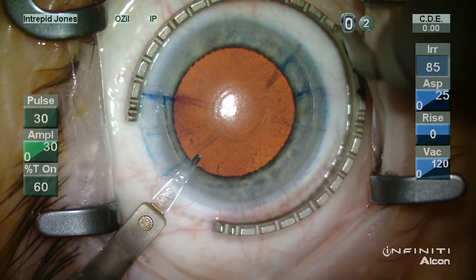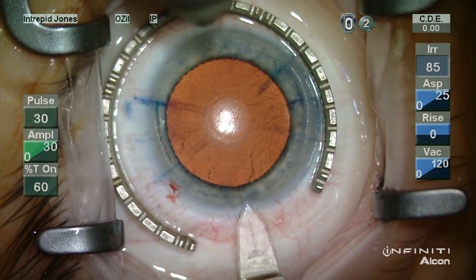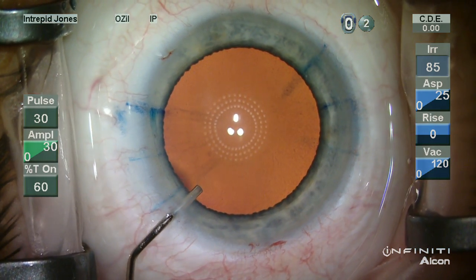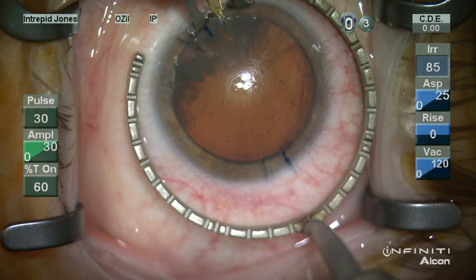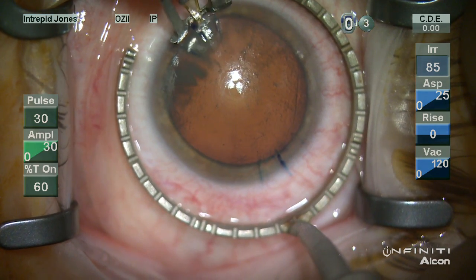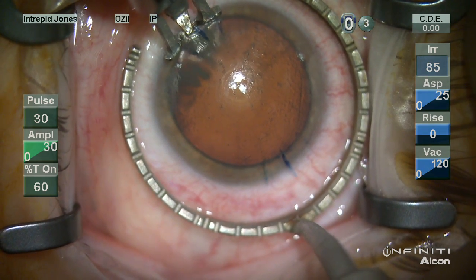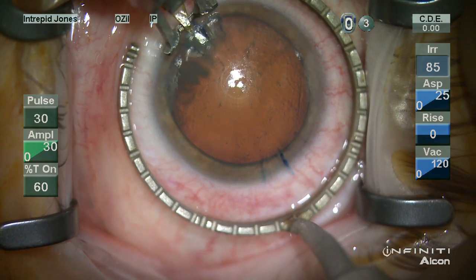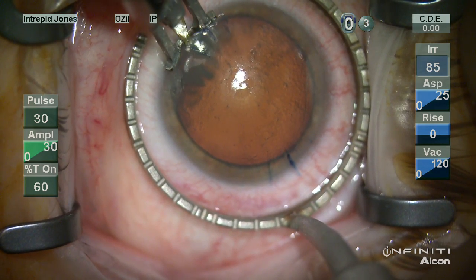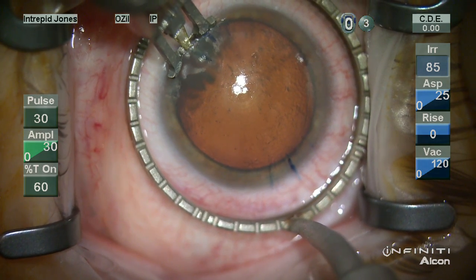The main wounds and the paracentesis are placed outside of these relaxing incisions. At the conclusion of the case you can note the roundness of the keratoscopic view. In this example we're placing our main wound on axis as well as using an LRI. You also see here this technique of lifting the blade and replacing it, which also tends to help if you're having any issues with rotation in orienting your blade in an arcuate manner.